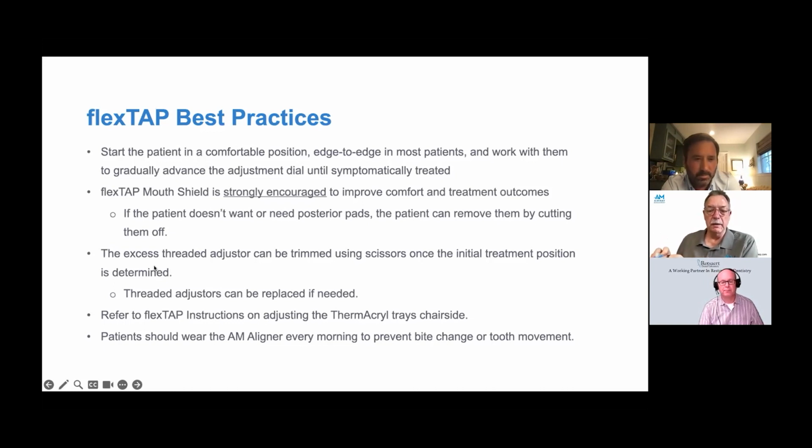Okay. Yeah. The short answer is, as a clinician educator, I don't really believe in the NTI effect of oral appliances. I believe in the NTI effect, but not when there's a whole arch of device there, for one thing. That's my differential, and you may disagree with me, which is fine. We don't have time to talk about it.